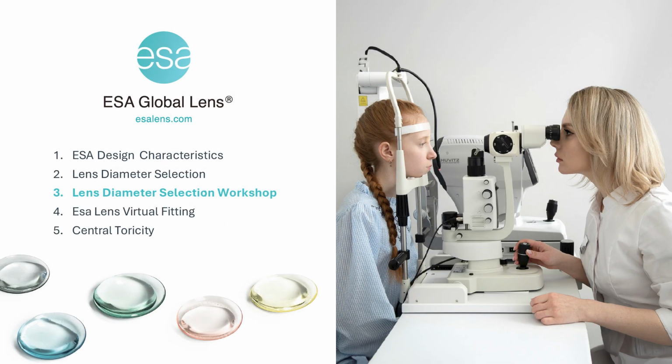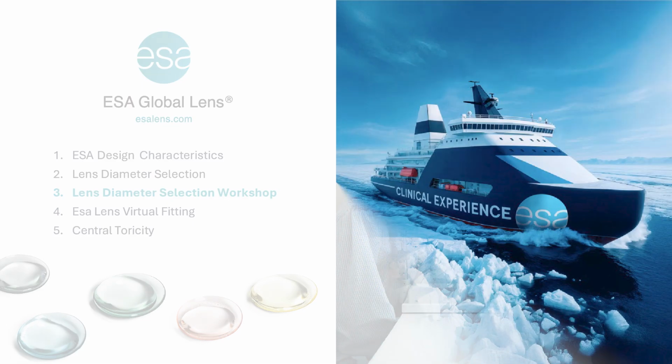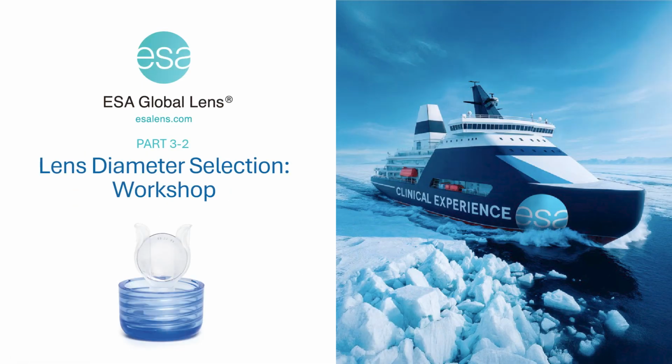Let's continue practicing diameter evaluation. In this section, we will examine 10 more real-life cases, concluding the topic of diameter evaluation.